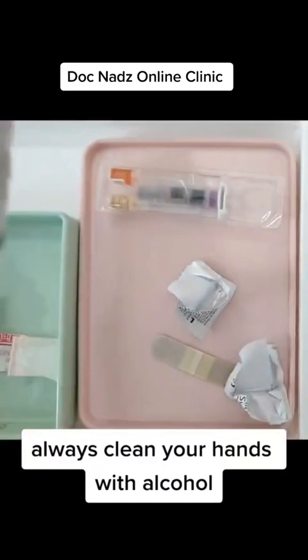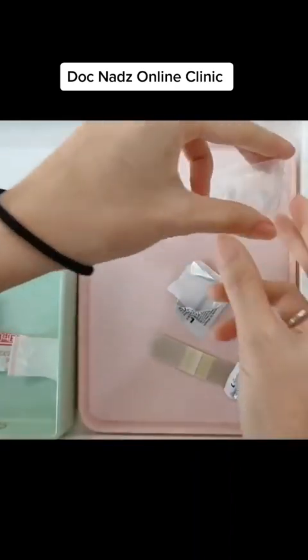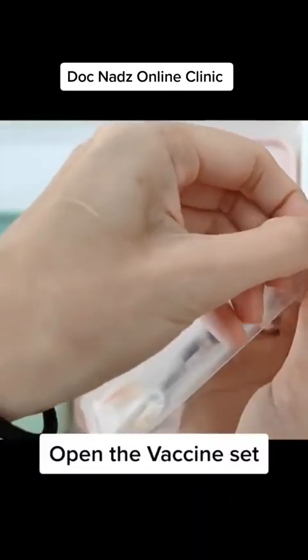Don't forget to clean your hands. Let's open the vaccine set.